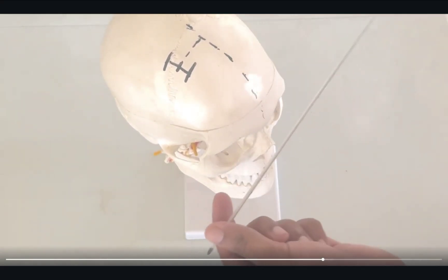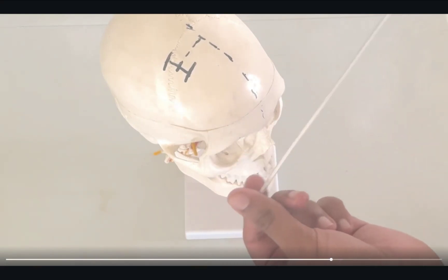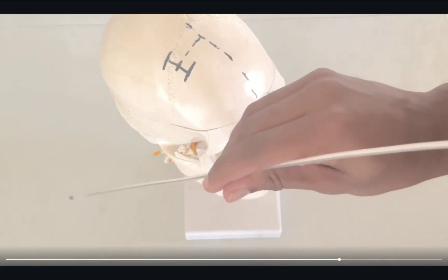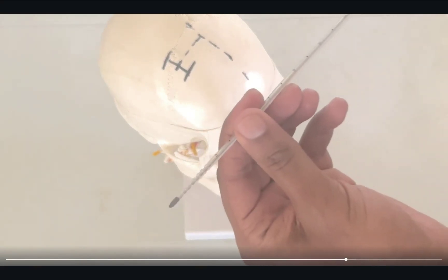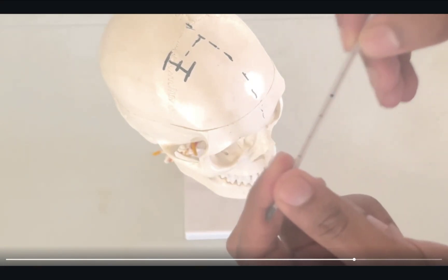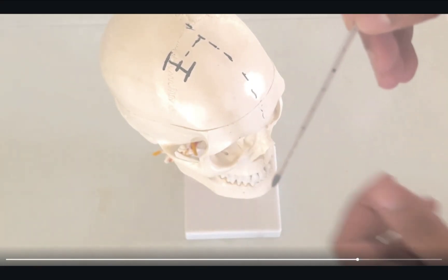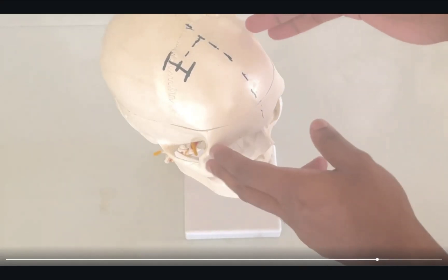Here's an EVD stylet. It has markings across. This one is more for trauma EVDs. You have a stylet on the top that you can take out. You'd make sure the stylet's all the way in. I always hold my finger around the five to seven centimeter mark, which is usually where you would achieve CSF flow. I rarely pass that point. If you measure on the CT scan, let's say it's six, I put my finger there so you're not going to penetrate past that.